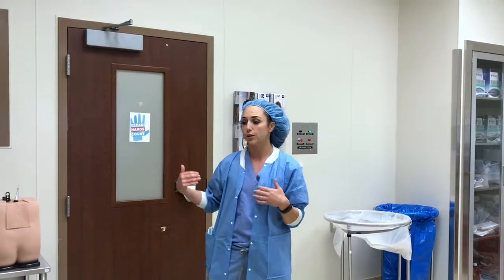Today I want to talk to you guys a little bit about the basic setup for some of the standard OB cases that you'll encounter. This first one will be a C-section setup. So one of the first things I do is I enter the core.